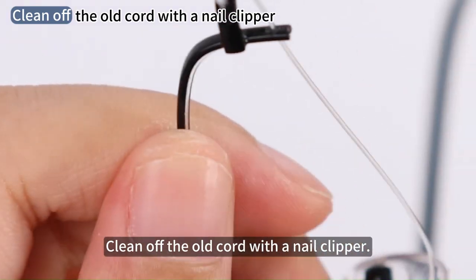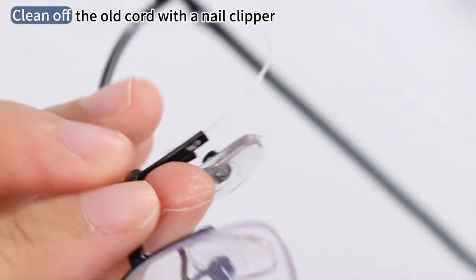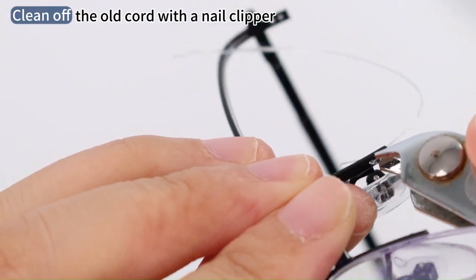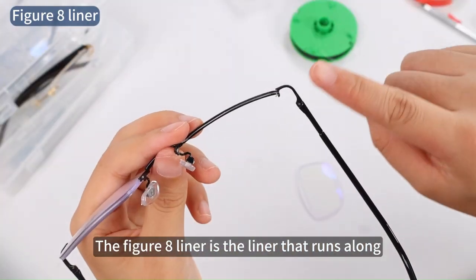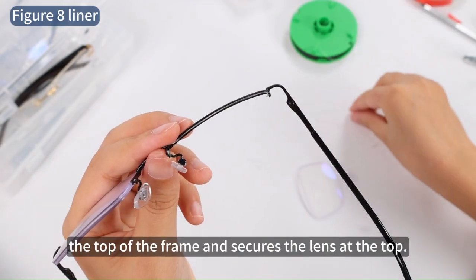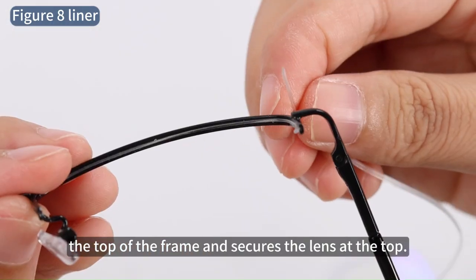Clean off the old cord with a nail clipper. The figure 8 liner is the liner that runs along the top of the frame and secures the lens at the top.